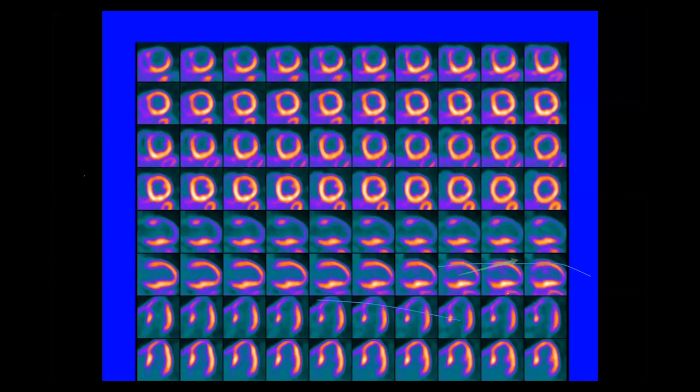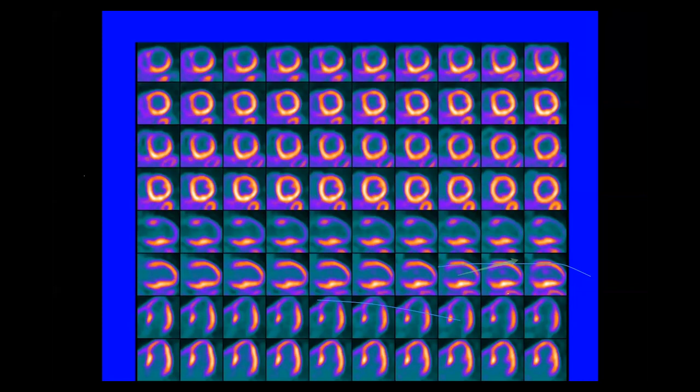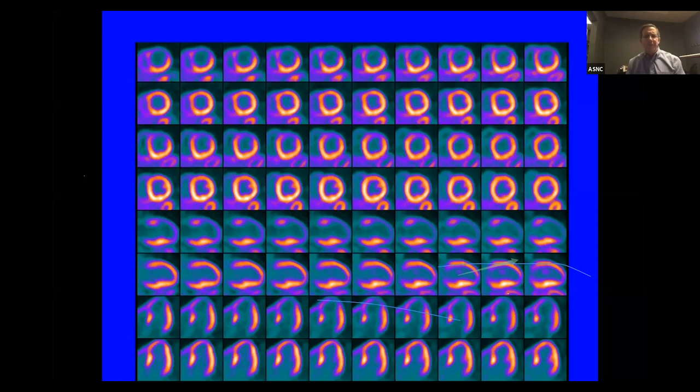Yes. Now you can see the RV better with this digital PET scanner than you can with a regular SPECT study or even our standard recent PET scans. Some of that is the better resolution of the instrument. But yeah, you do see the RV. Right, so this seems like a very high risk study, something involving a major left main or proximal LAD. As you say, a big defect, it's mostly reversible.